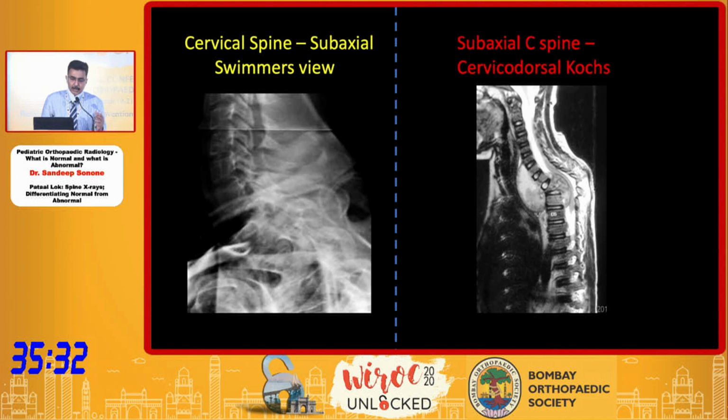Certain radiological examinations like a swimmer's view, which is essential, and an open mouth view, which are essential for you to have a diagnosis or suspect a diagnosis in a particular area.